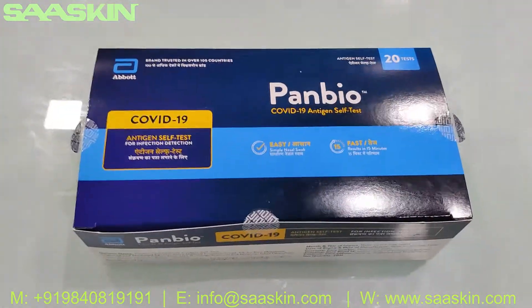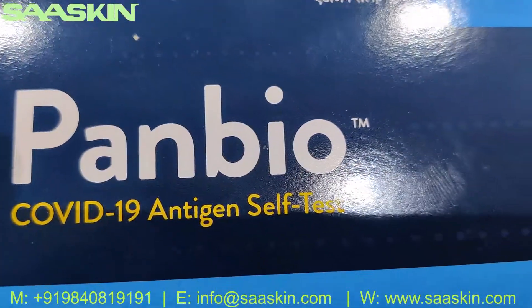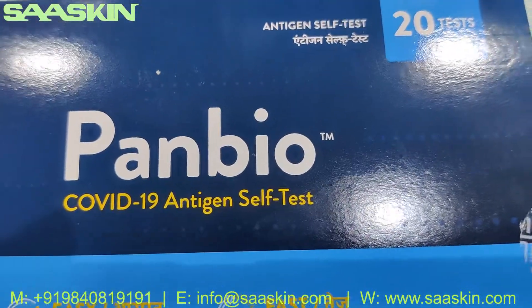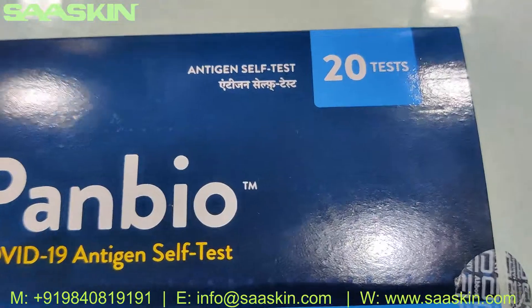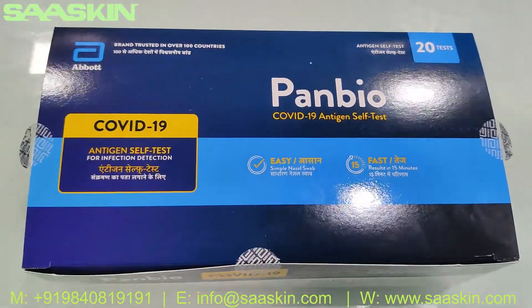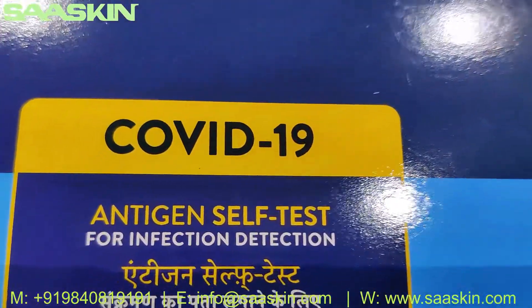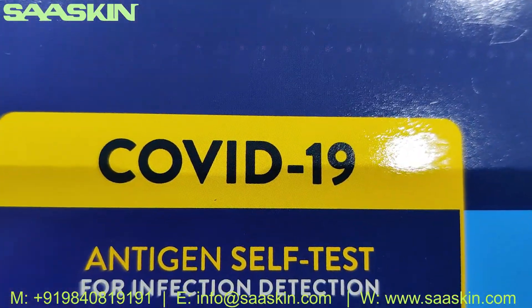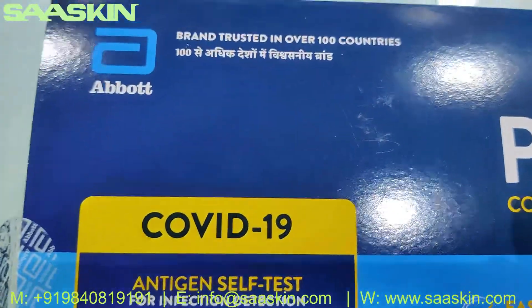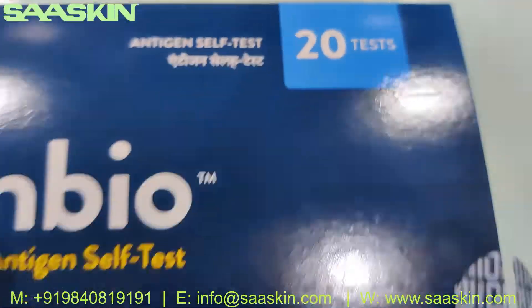Hello everybody, today we're going to see the unboxing of the Abbott Panbio COVID-19 Antigen Self-Test. This is the 20 test kit pack. This is how the box looks — it is a 20 test pack.